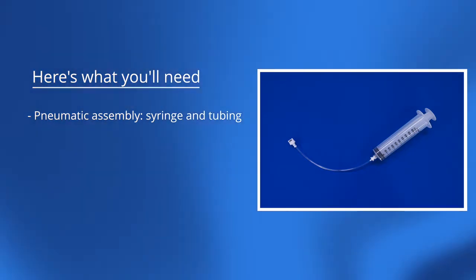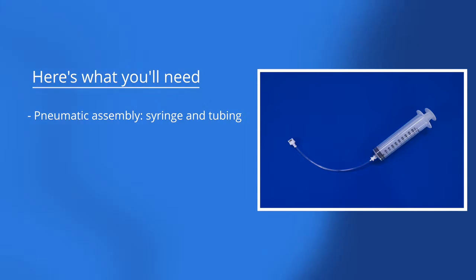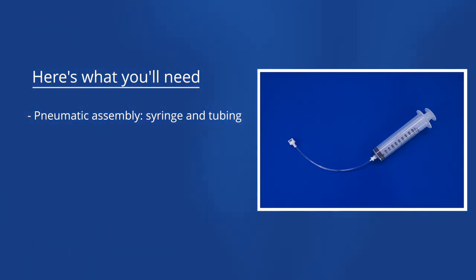This video shows you how to simulate a bulging or sunken fontanelle with Luna. Here's what you'll need: pneumatic assembly, syringe and tubing.